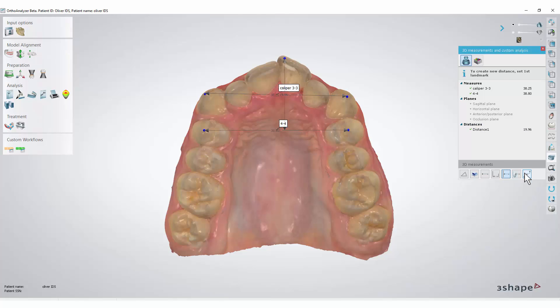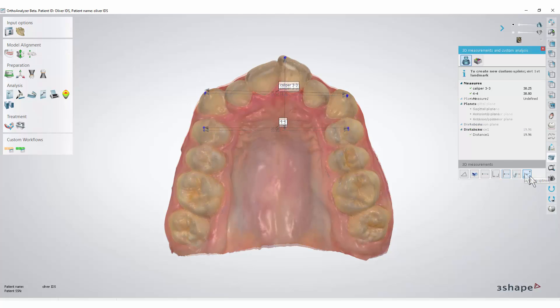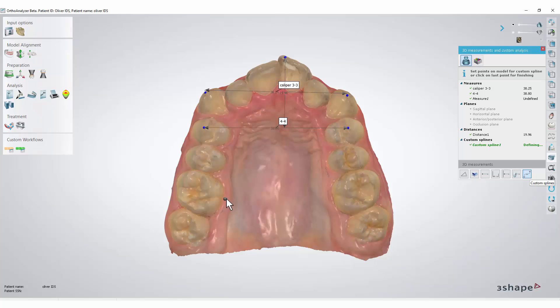Also, we are able to make custom splines. Just make one by putting points on the scan, and double-click on the last point to get the measurement.